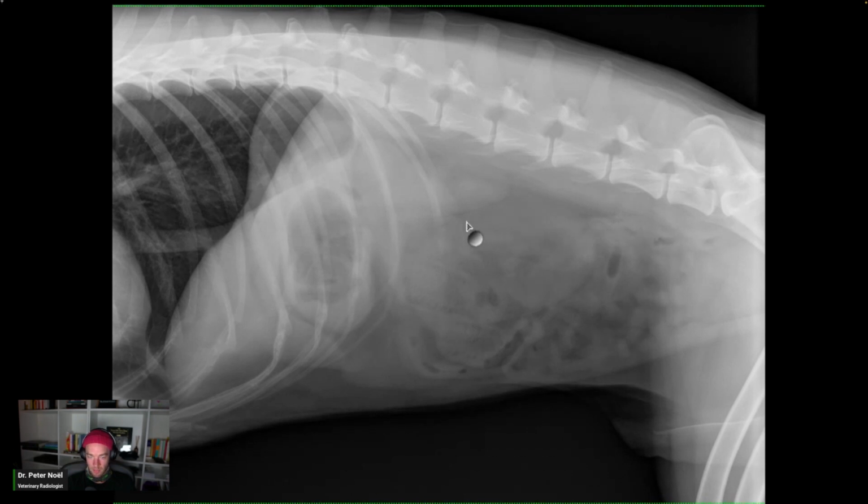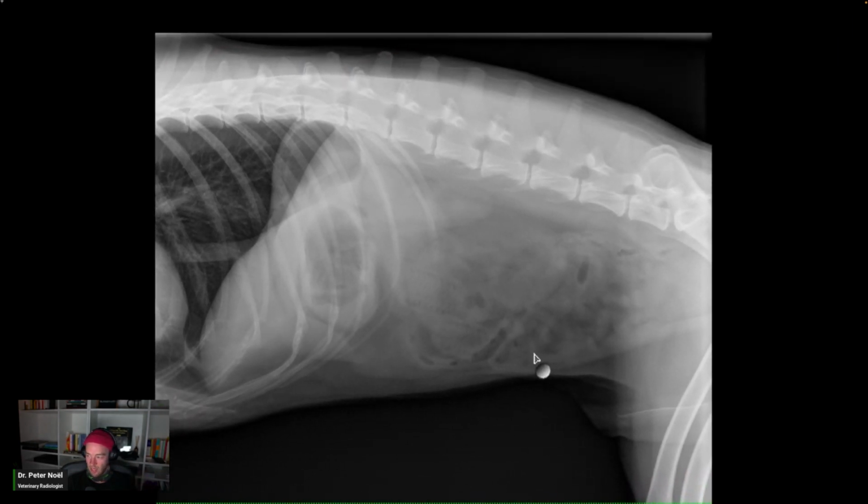The colon does this. It comes out here, and then it loops around, and then it does this. And then there's this like cecum. Okay, so it doesn't do this. And then you go, okay, corn cob, this is way too big, and these are small, surgery. Next case. Don't make it any more complicated.